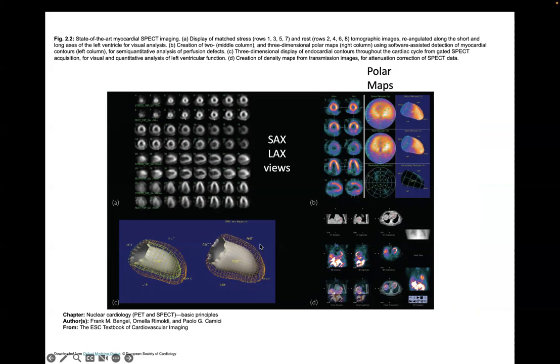And on problem set 1, you guys created 2 types of left ventricle, one that was a cylinder and one that was a sphere. They're usually somewhere in between. A short axis view of the left ventricle looks like a donut, and that's when you cut it along one of these planes that cut through the left ventricle. And so you can see the myocardium all the way around the short axis view.